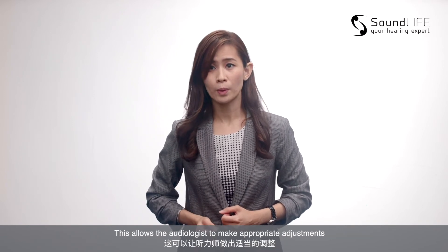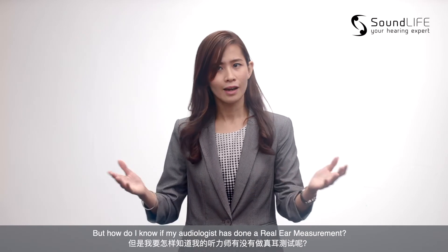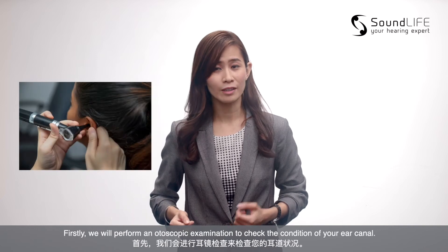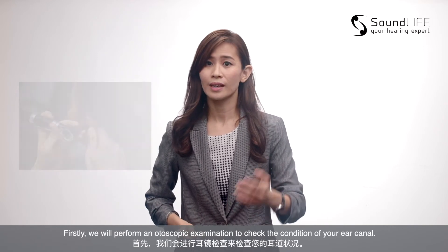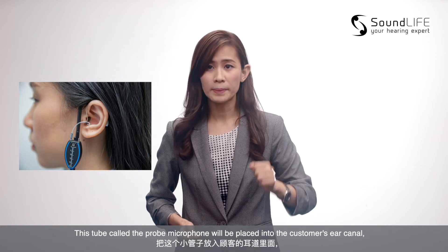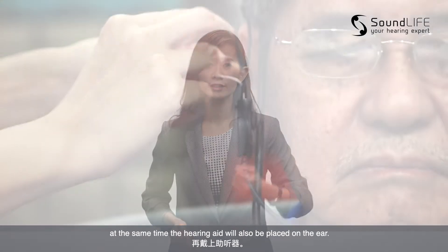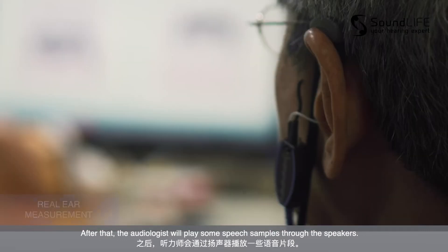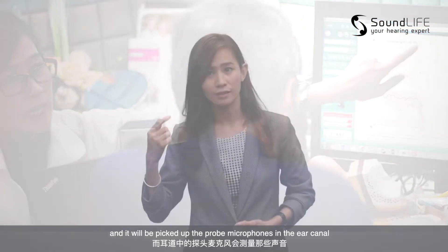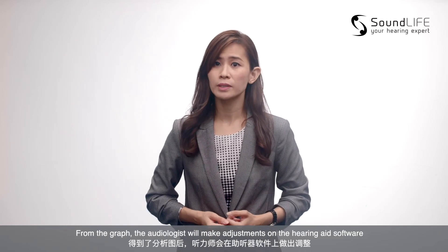This allows the audiologist to make appropriate adjustments and allows customers to obtain the best hearing improvement possible from their hearing aids. But how do I know if my audiologist has done a real ear measurement? What kind of process is that? Firstly, we will perform an otoscopic examination to check the condition of your ear canal. Then, we will put a device like this on the customer's ear. This tube, called the probe microphone, will be placed into the customer's ear canal. At the same time, the hearing aid will also be placed on the ear. After that, the audiologist will play some speech samples through the speaker. The hearing aid will amplify those sounds and it will be picked up by the probe microphones in the ear canal. A graph will then be generated on the computer software. From the graph, the audiologist will make adjustments on the hearing aid software. This is roughly how real ear measurement looks like.